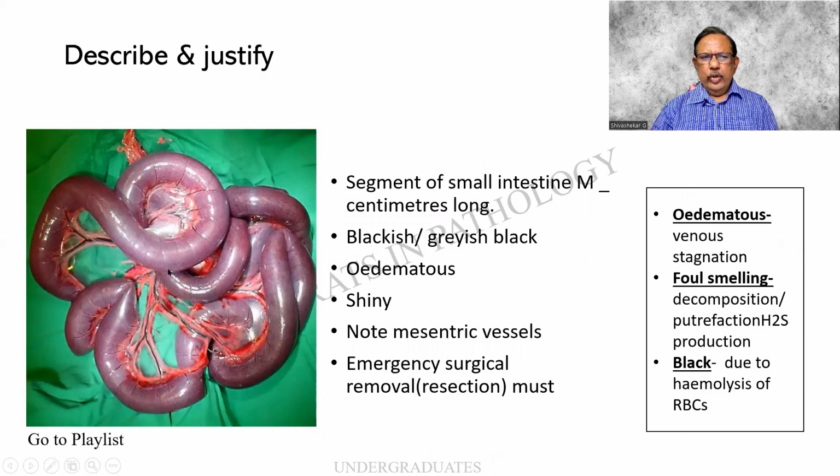I am finding loops of the intestine, and these are the mesenteric blood vessels. Normally, whenever there is a rotation, there are two vessels to a region. One is an artery, the other is a vein. The veins are more easily compressible. Therefore, the blood does not leave the region. Arterial blood, in turn, cannot enter. The blood is utilized. It is devoid of oxygen. That region becomes gangrenous.